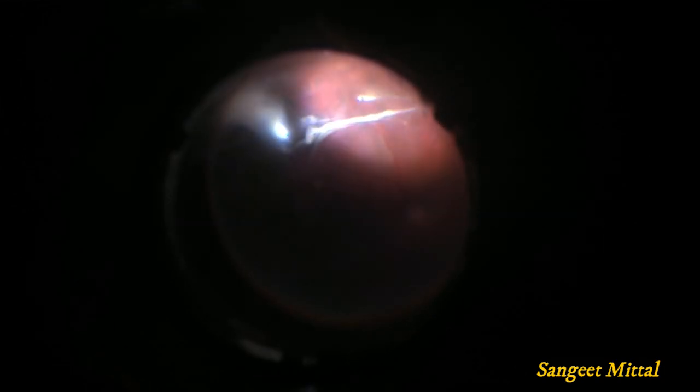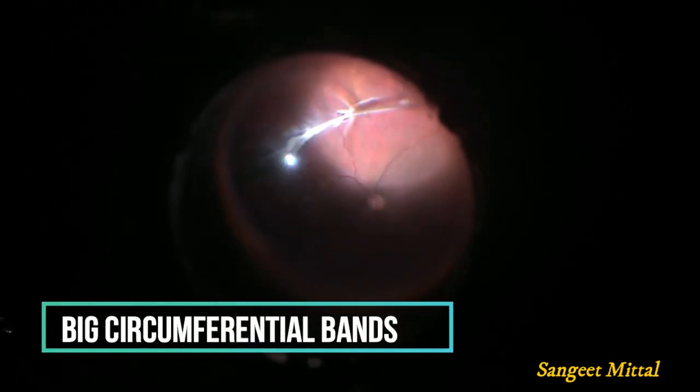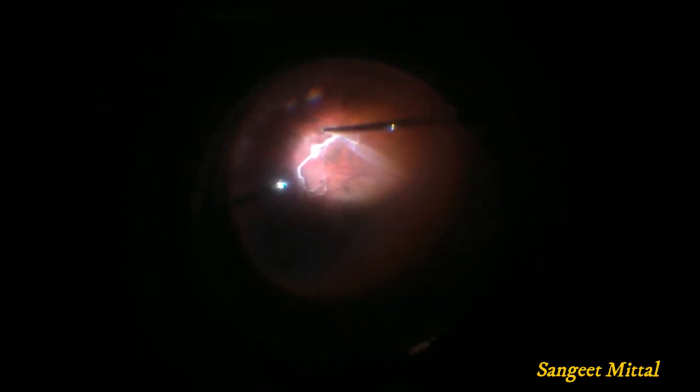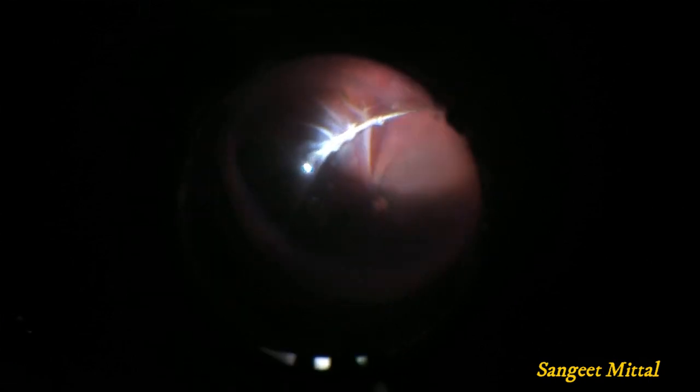Sometimes the bands are too long and while pulling them they tend to slip back into the retina. This problem can be avoided by using the spaghetti technique. In this, two instruments are used to pull the sub-retinal band — you can either do bimanual surgery and use two forceps, or you can use your light pipe to roll out the band.